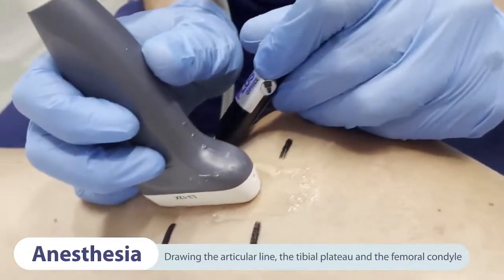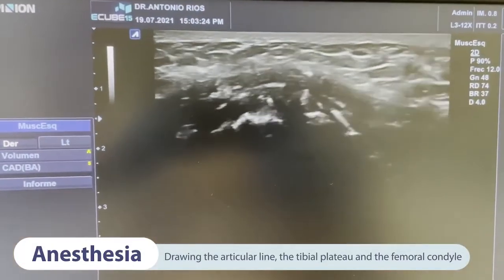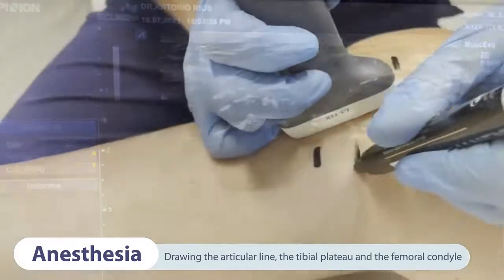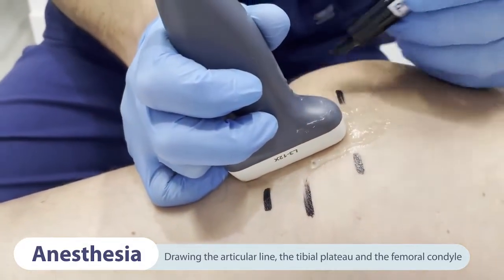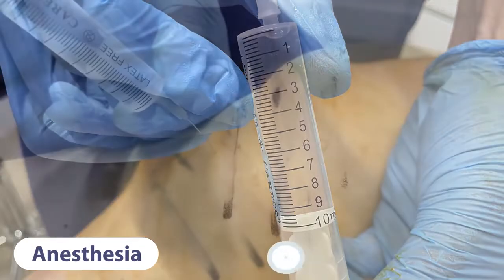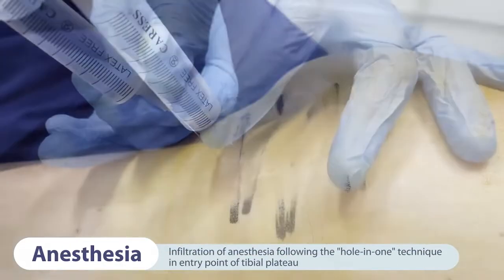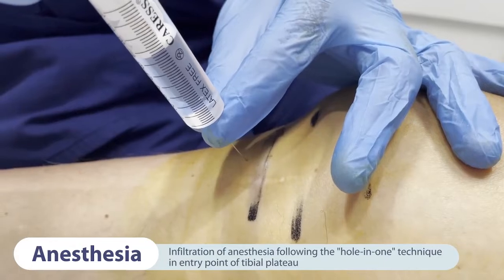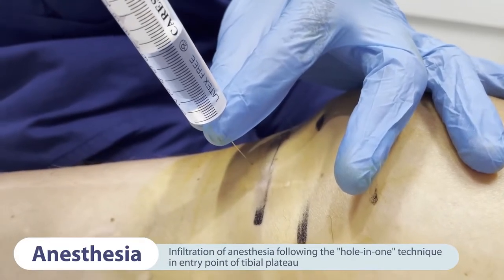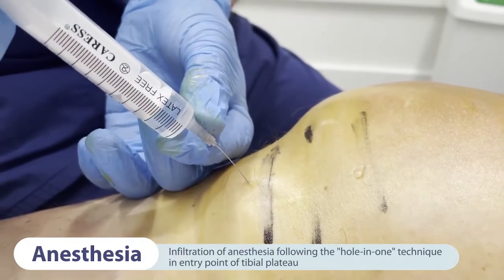Anesthesia is performed according to the Wallent technique. The injection procedure is known as hole-in-one anesthesia. We start with the tibial plateau by placing the needle on the skin landmark drawn as insertion point and inject the first 2-3 millilitres under the skin very slowly. Then we reinsert the needle through tissue already anesthetized and administer 3-4 millilitres of the solution in a star manner, by angling the needle appropriately and moving it very little.